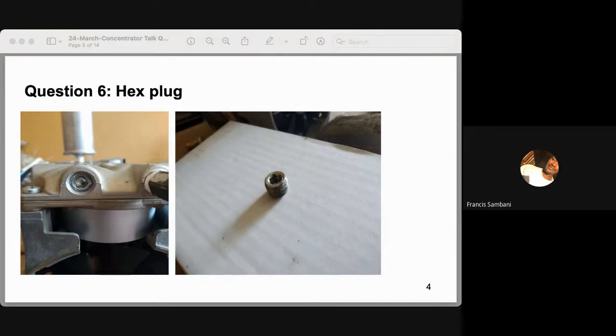Then you can check if the output pressure has improved by reconnecting everything back as it was, as in the test previously discussed. This should help correct the problem of low pressure that you were experiencing.